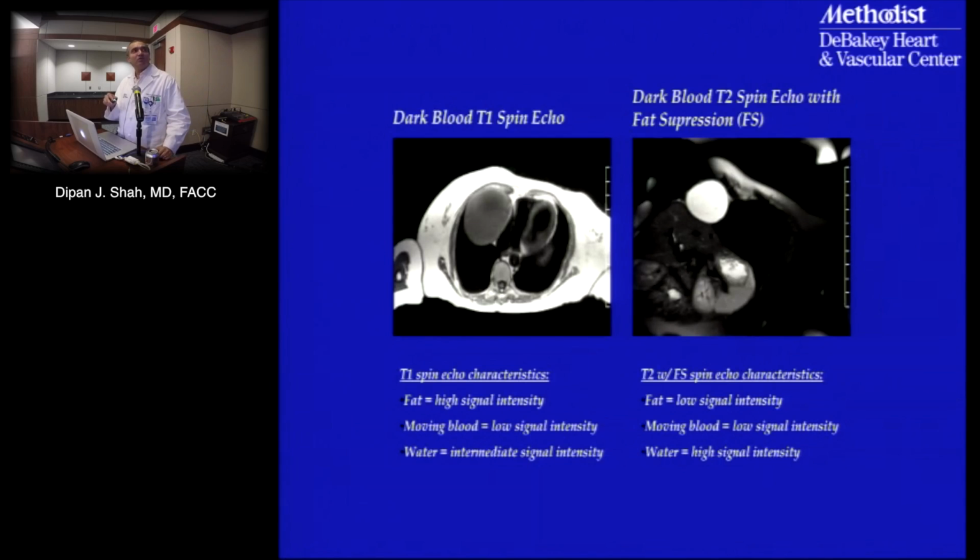Okay, and so on a T2 weighted acquisition, since water has very slow T2 decay, a long T2 time, water will appear bright. So the same tissue can appear very different depending upon what pulse sequence I'm utilizing. So first, before I decide on what the characteristic of something is, I need to know what pulse sequence was used to generate that image.